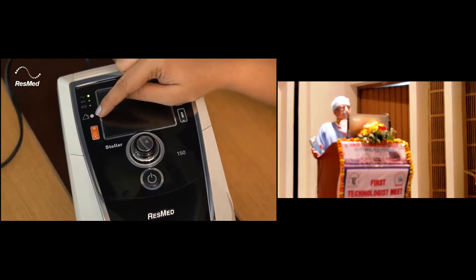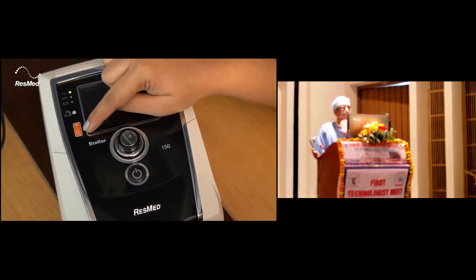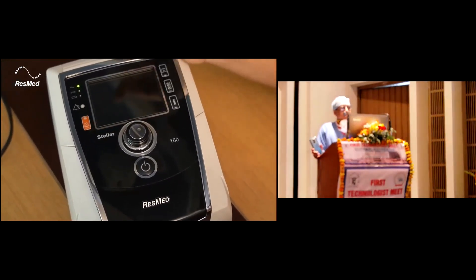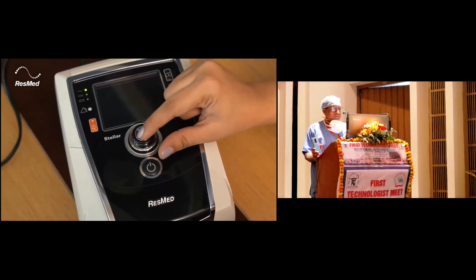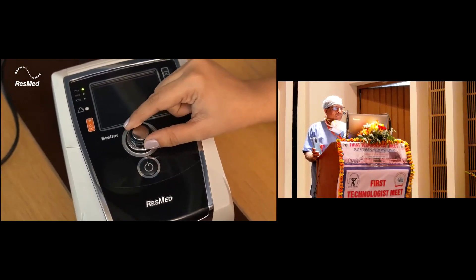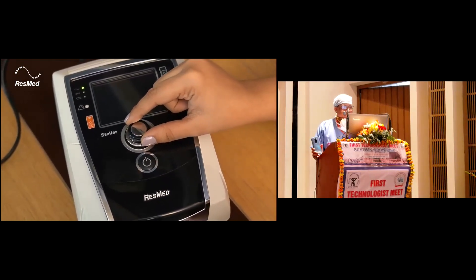If there are any alarms, this will be lit, and if you want to mute the alarm, this is the alarm mute button. Over here we have the dial which can be rotated or pressed, and that's how we use it to change the settings.